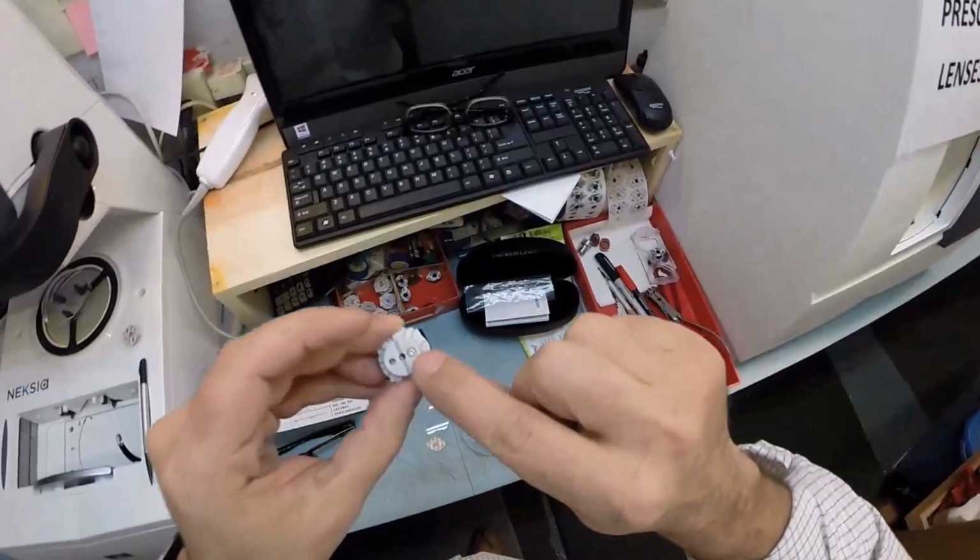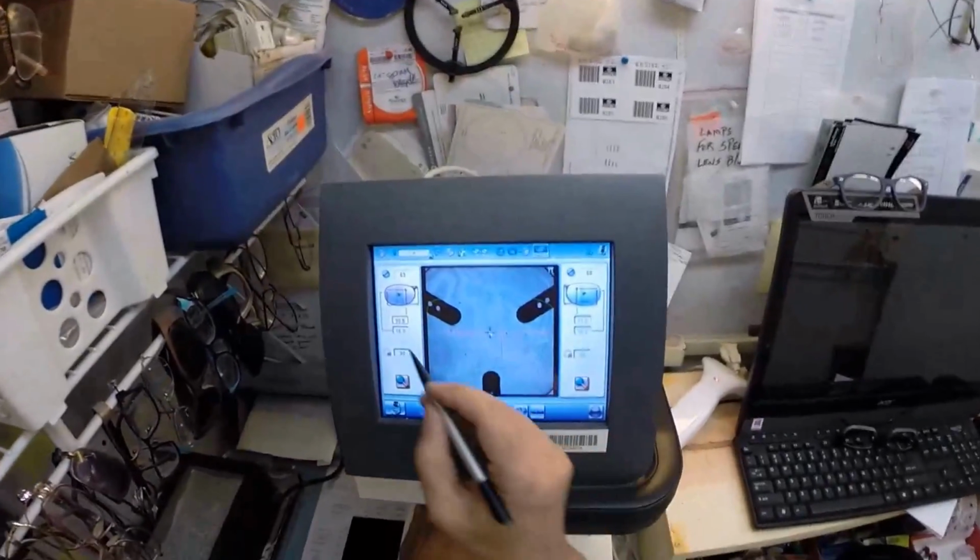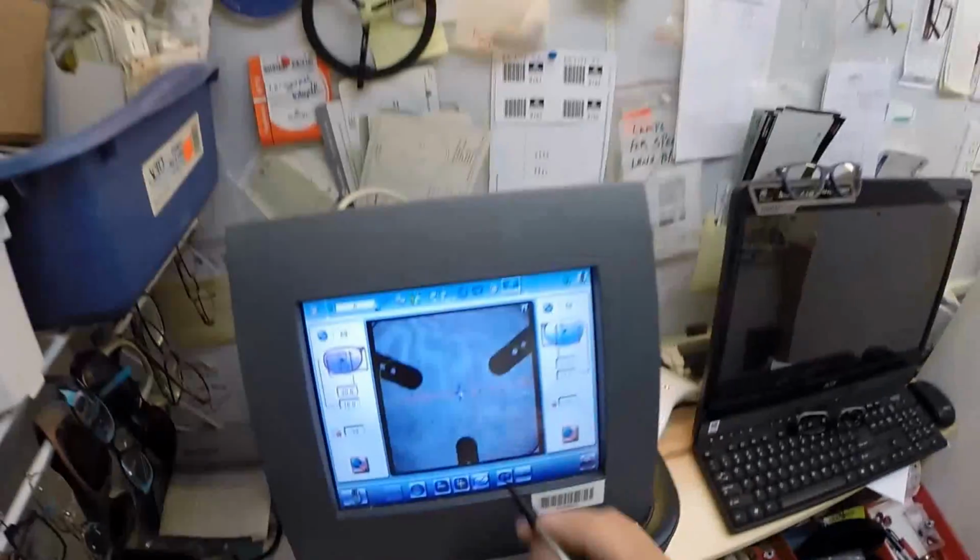And there's a little silver button on the back. That is a magnet. It does 2 things. It holds it in place in this arm and then inside the edger. So I've already got your pupillary distance of 30.5 typed in there.